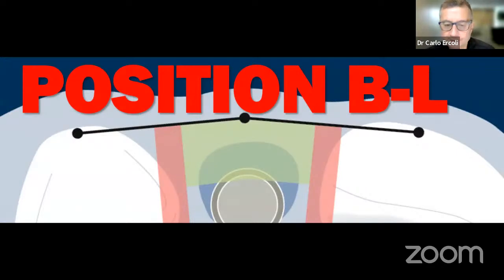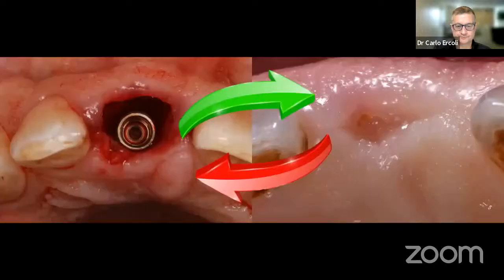Now, what about buccolingually? We said that the last thing that we want to do in any situation, but especially in an immediate implant, is to place the implant towards the buccal bone or touching the buccal bone. We must be towards the palatal bone. Again, this is no different if you have an immediate implant, like you have on the left side, where you're placing the implants towards the palatal component, and then we will see later, we're going to graft with some slow resorbing, generally xenograft bone, that gap between the implant and the remaining part of the socket.